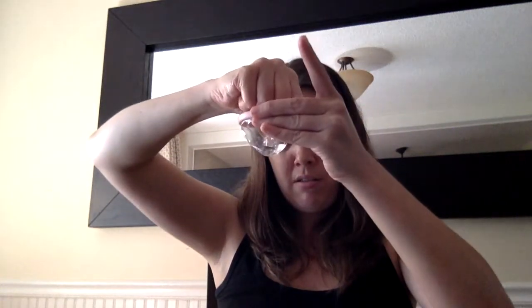So as promised, I want to show you how much this actually holds. Let me squeeze out just enough so that we don't want it at leaking capacity. We just want it at absorbing capacity. All right, so here we are. I've got this as absorbed as I can without leaking. So think that this would be the maximum time before you would need to excuse yourself and go and rinse it out and get a second one. So first I'm going to squeeze the fluid from here into the soft cup.